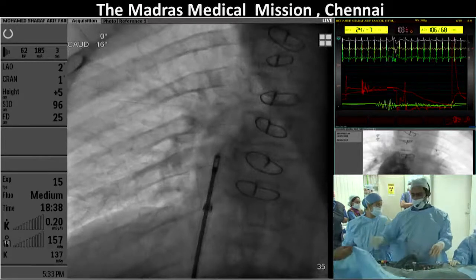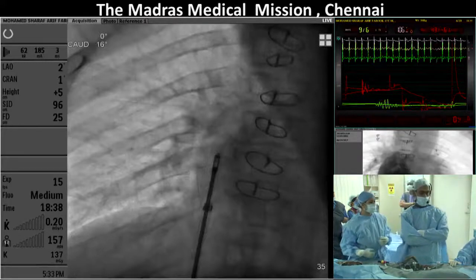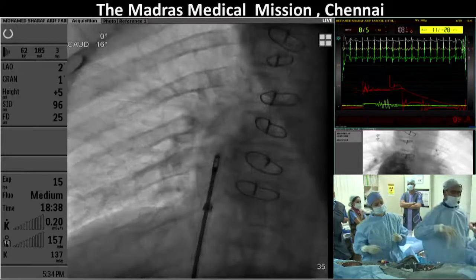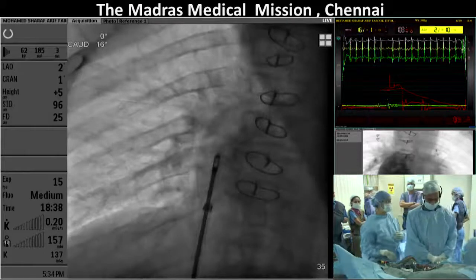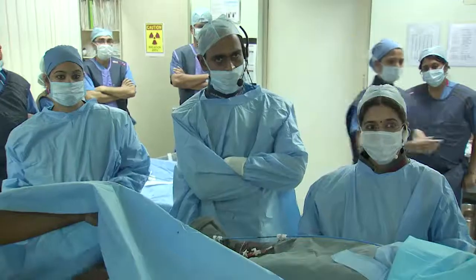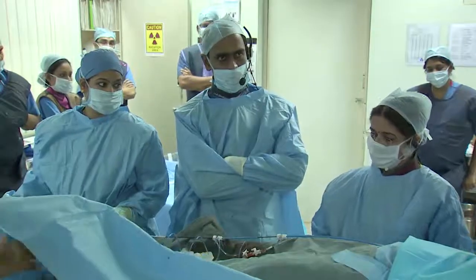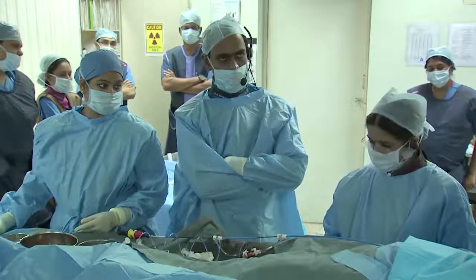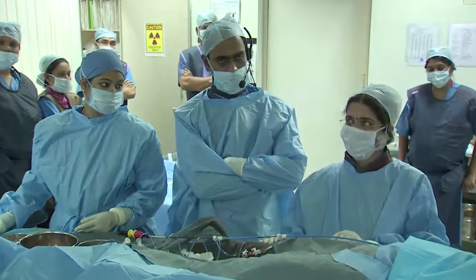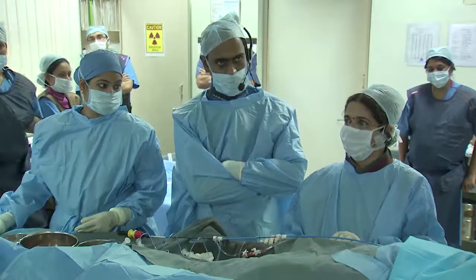You have a question over here in the right front. Hi, this is Dr. Ashish from India, PGI Chandigarh. Hi, sir. Thank you for a brilliant case here. I have two questions for you. First, your experience regarding this atrial flow regulator and changing the aperture diameter previously. And second, in the condition like this where, after closing, you get the PA pressure around 13 or 15, your opinion regarding complete occlusion of this fenestration.